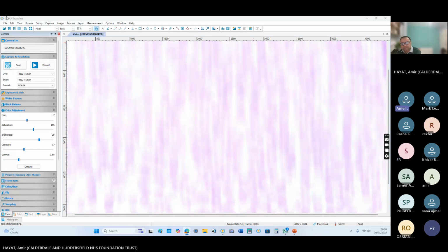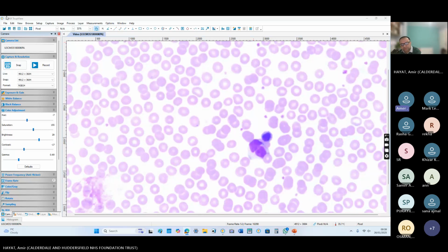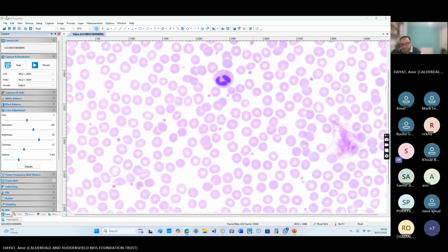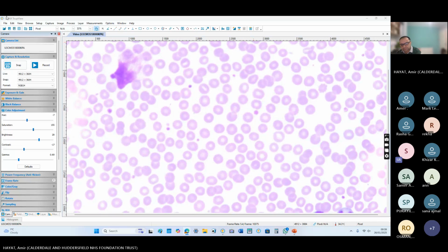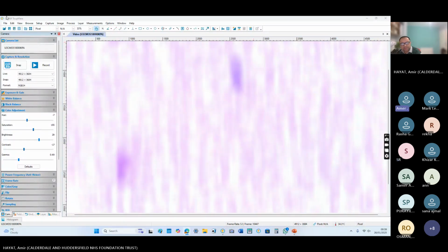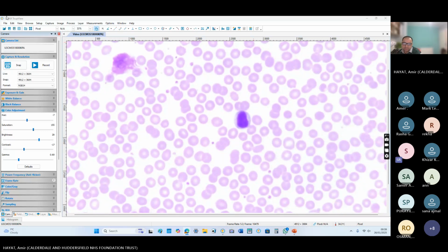So who is this speaking? I'm speaking, Dr. Sindhu. Dr. Sindhu, you may have heard from me before: comment on the abnormal cell line count. Okay. Can you repeat what was the CBC count in this patient? Hemoglobin was 122, white cell count was 17, and platelet count was 210. WBC 17, okay.